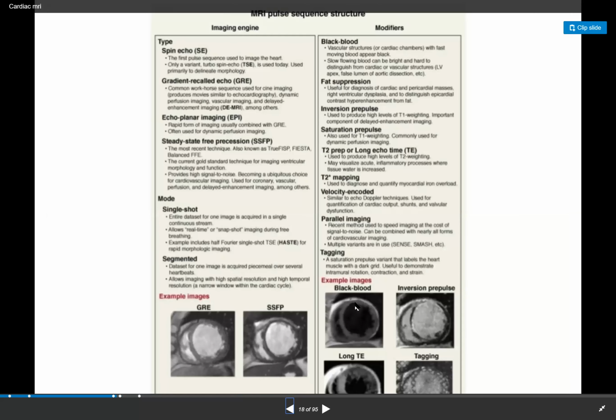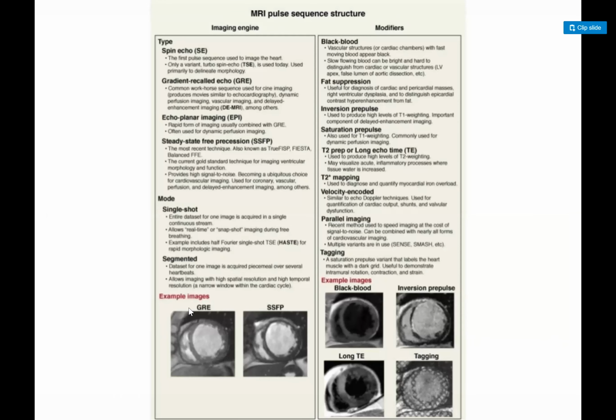If you go back a slide, way back when I was a fellow, we had the gradient echo imaging, which we used to call cine MRI. Would you say it is a fair statement that the Fiesta or TrueFISP has basically replaced what we used to call gradient echo?